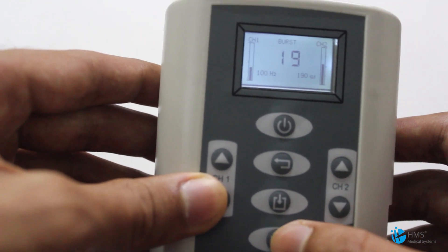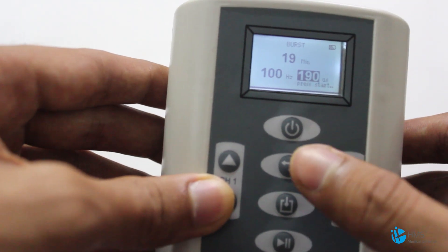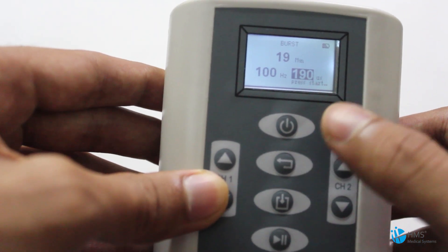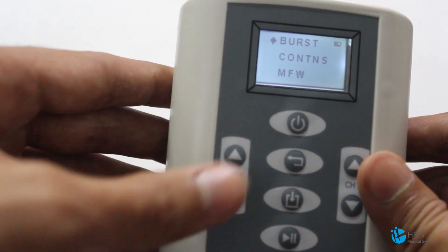This is the Pause button. Press it and the treatment gets stopped. This is the Back button, and you can navigate through the other modes.